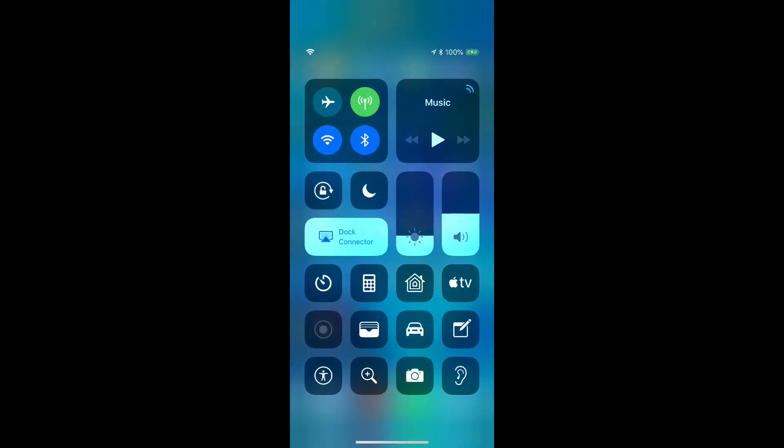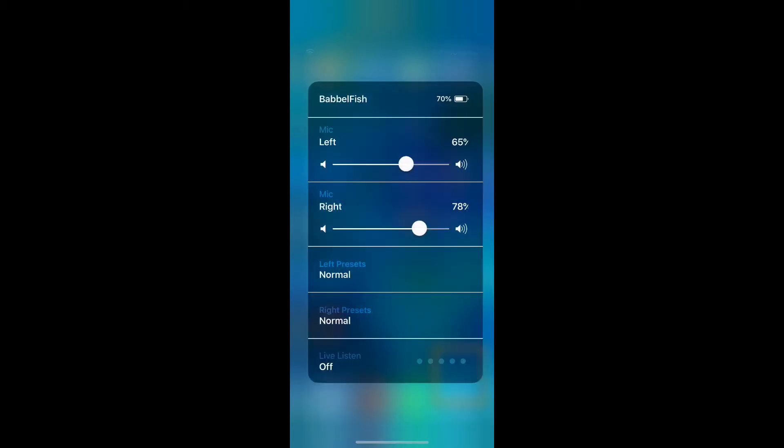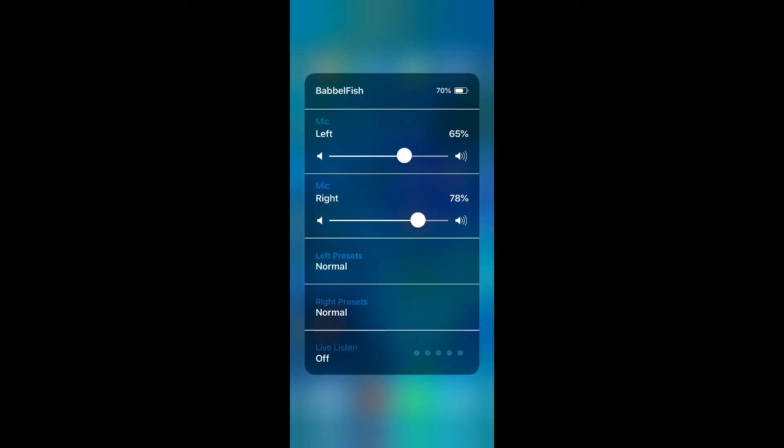We now see the little ear icon. I'm going to select that and we have hearing aid controls. This is completely separate from the open app.